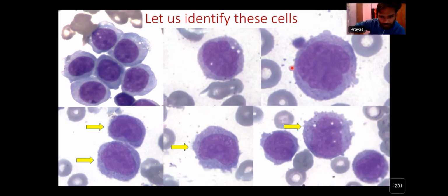Sir, slightly indented nuclei. So the nuclei in these cells are reniform. When you have heard of the term reniform, what does reniform mean? Kidney shaped. So these are typical reniform cells that you see here, but the nuclear chromatin is very fine. All right, lace-like as it has been described. And sometimes these nuclei have folds like that of the brain. If I were to draw a cartoon image of the brain, it would look like this.